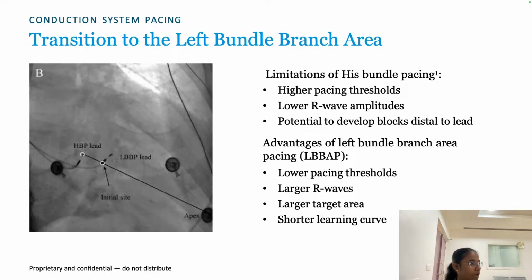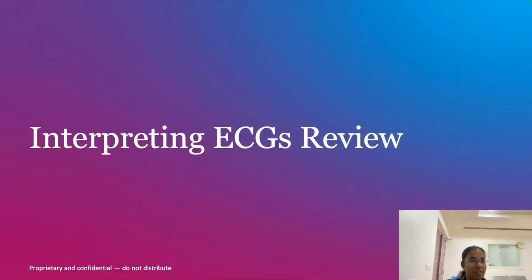So it will be a kind of fusion of left bundle and septal pacing, which is also better than RV pacing. But the QRS morphology will be a little wider compared to pure selective pacing. So in selective pacing, through ECG we can go through the interpretation, the discordance, in which lead we have to focus.